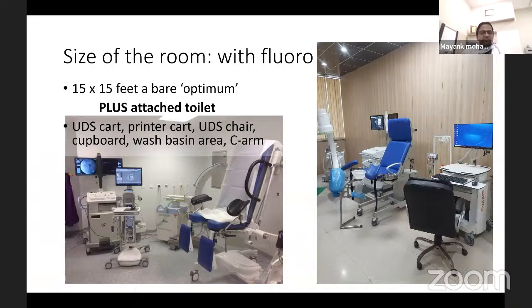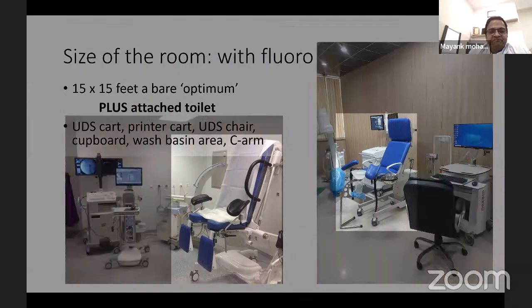These are the two examples. The one on the left is from MSKCC, where I was in 2009. And on the right side, this is the one from AIIMS Rishikesh. So Dr. Sandhu and Dr. Ankur Mittal respectively have been kind enough to share these photographs.